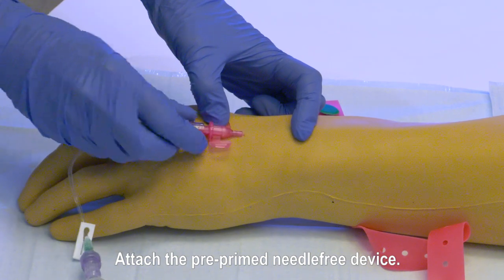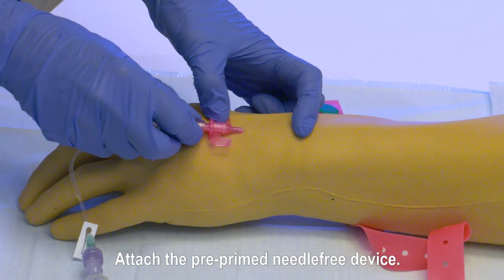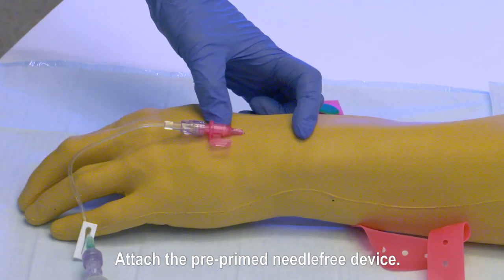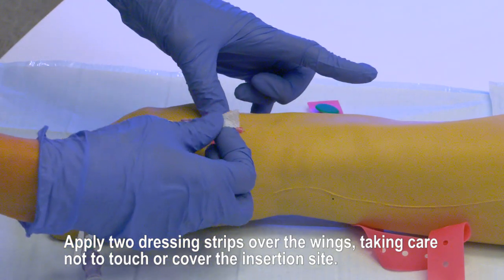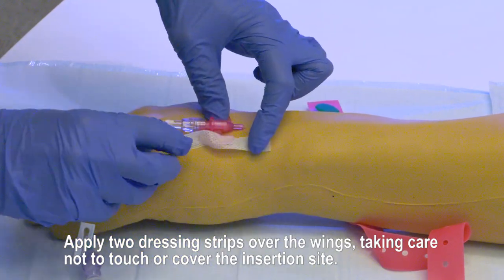Attach the pre-primed needle-free device. Apply two dressing strips over the wings, taking care not to touch or cover the insertion site.